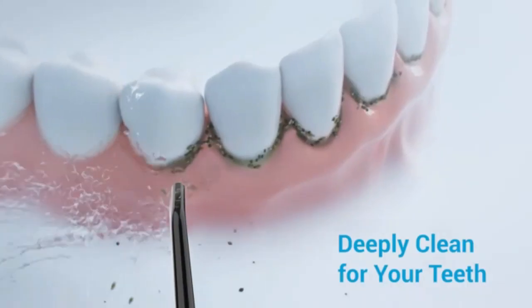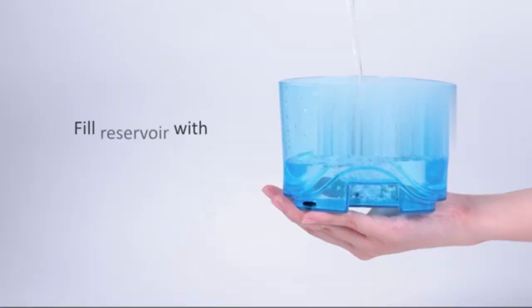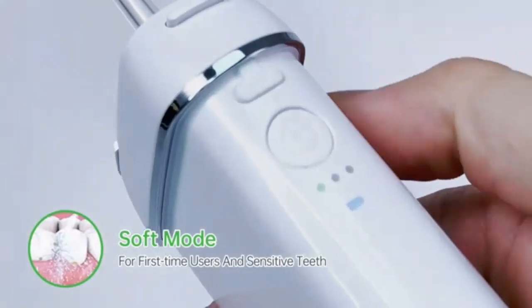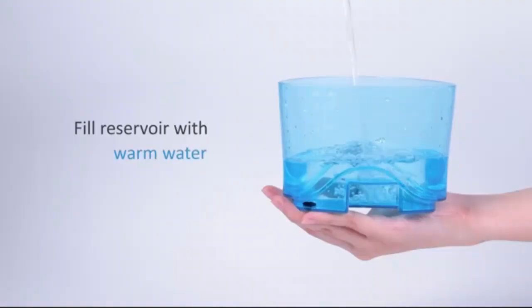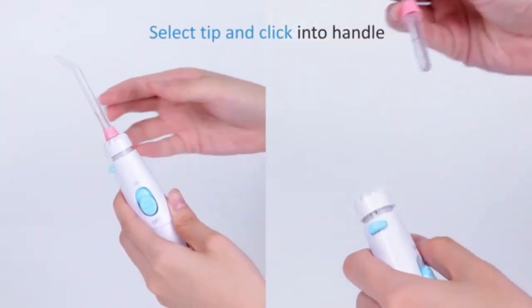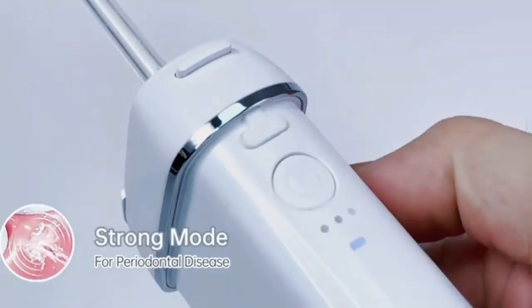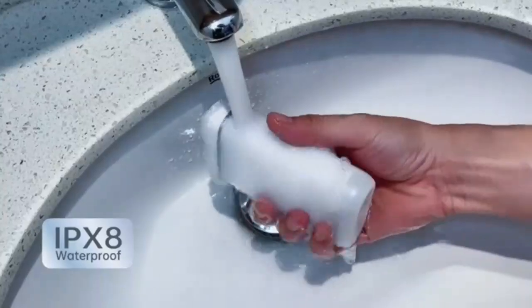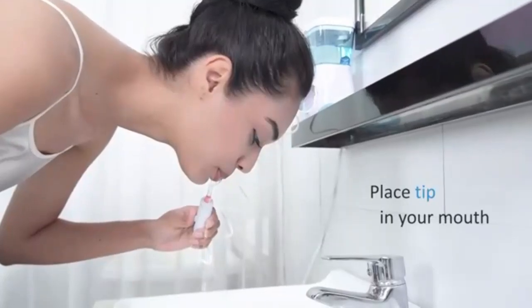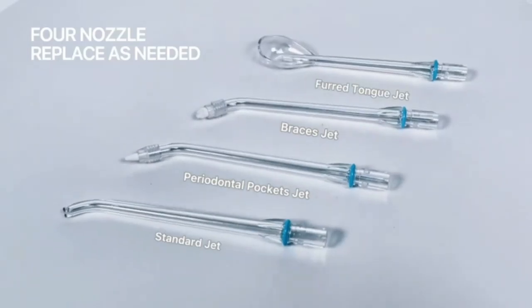Experience professional-level oral hygiene wherever you are with the MySmile LP211 Cordless Advanced Water Flosser — the ultimate tool for maintaining optimal oral hygiene. This sleek, portable flosser features advanced water pressure technology, effectively removing plaque and debris from hard-to-reach areas for a dentist-level clean at home. With three adjustable pressure modes and a 300ml water reservoir, it delivers a customized cleaning experience for every user. Its cordless, rechargeable design offers convenience, making it ideal for both daily use and travel. The IPX7 waterproof rating ensures safe use in the shower, while its ergonomic handle provides a comfortable grip.